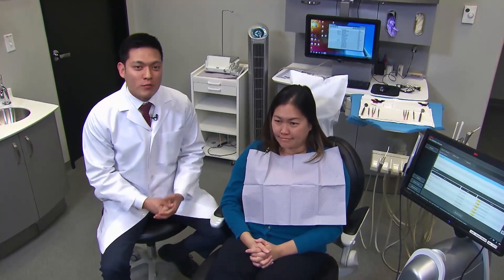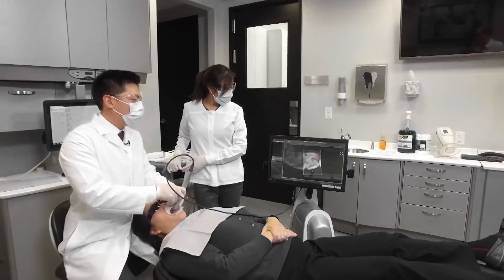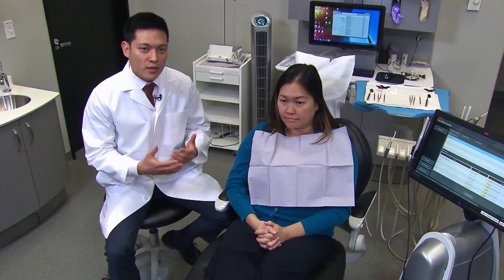For today's case, our patient's chief complaint is grinding and clenching at night with headaches in the morning. We're going to prescribe for her an Astron Clear Splint, and for this case we're going to take it through the digital workflow, scanning it with a 3M True Definition camera. Without any traditional impressions, we can send it digitally, which expedites the process and makes it a lot more comfortable for the patient.